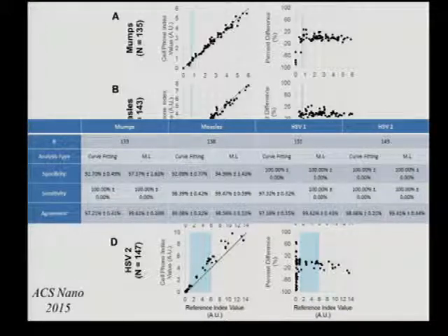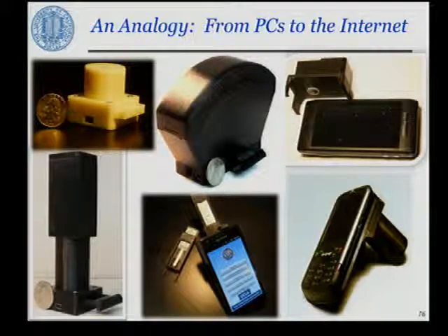Imagine you want to screen a village to understand how well they're immunized. Right there, do immunization if needed. This kind of platform would be unique because now you can have hundreds of people within a few cassettes be screened, and the results will come within just a few minutes per cassette. So it's essentially server transmission, and then under 30 seconds the results come back processed.